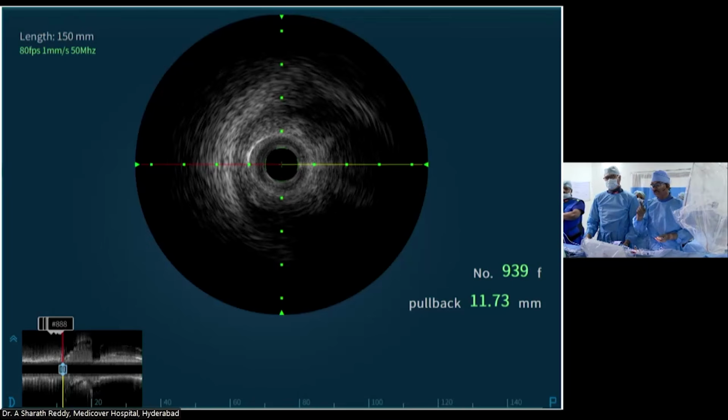Yeah, so to use a dual lumen catheter from this branch, the wire is not going distally. The wire is just stuck at the bend in the vessel there. Yeah, I think that's a nice choice, but honestly, I didn't consider that option. Okay, so you go to the retrograde.